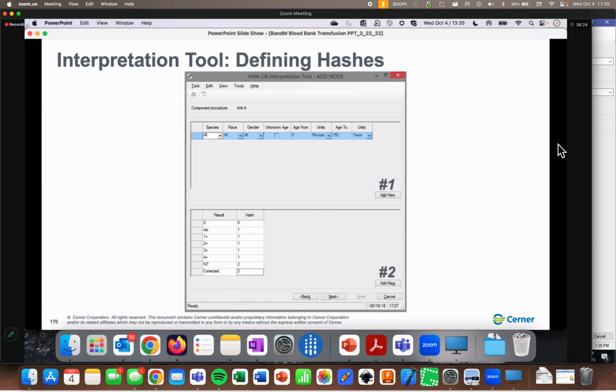So really all I'm concerned about is a 0 reaction or a positive reaction with any of those different positive choices. That means that, for blood types anyway, I actually only need 1 interpretation pattern for every blood type.